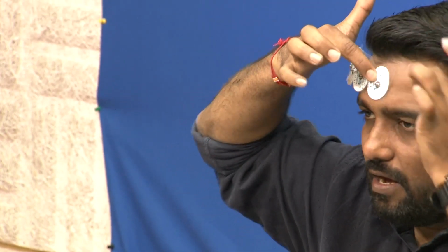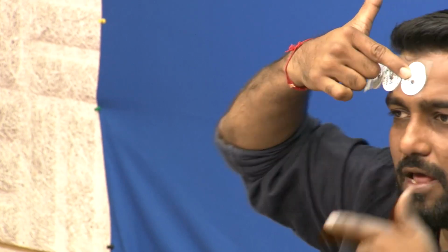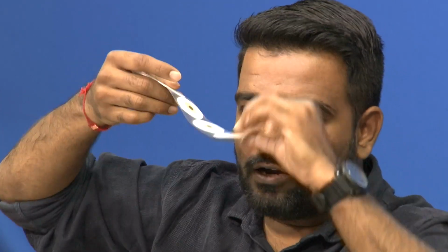You can only get a better signal when you put a gel. When you put the gel, the impedance will reduce. So, to reduce this impedance, we have to put a gel, and the conduction is here on the electrodes. These are the buttons, right. To hold the electrodes, you can place them like this.